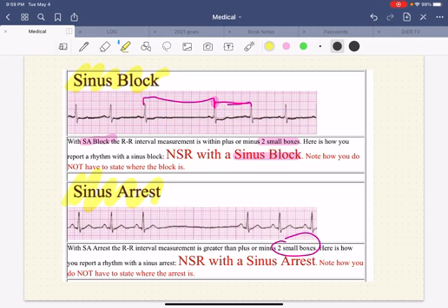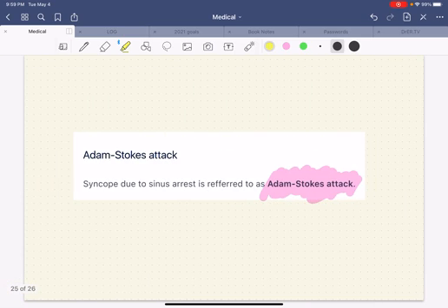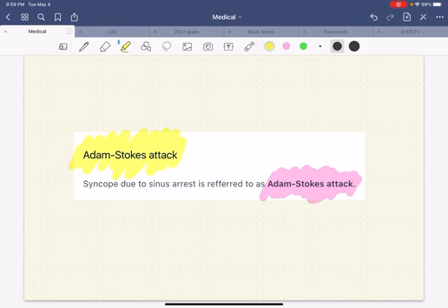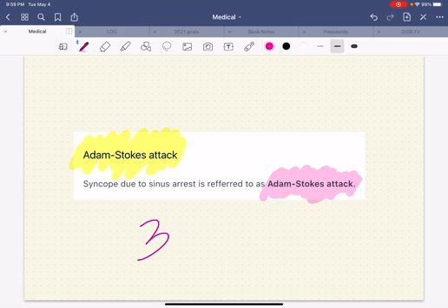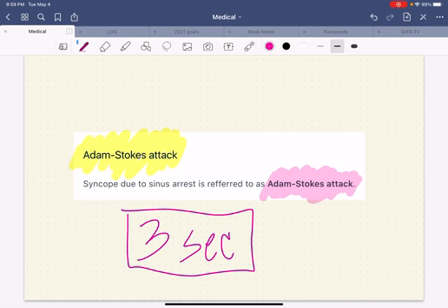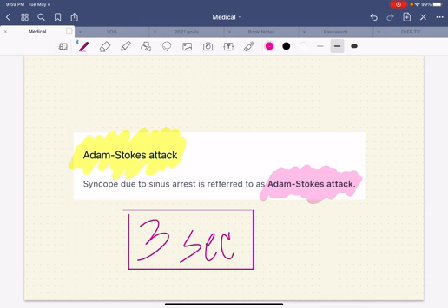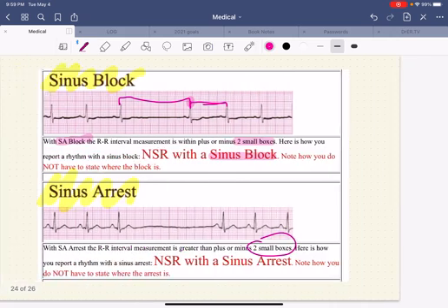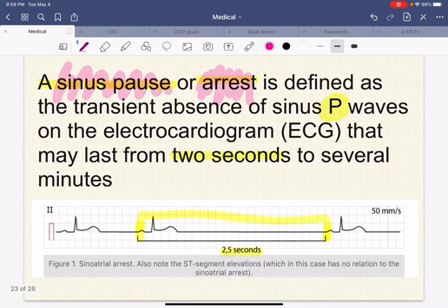The difference between sinus block and sinus arrest is that there is a pause but it doesn't meet the criteria of more than two seconds. If somebody passes out because of a sinus arrest, we call that an Adam-Stokes attack. For people who have more than three seconds of pause and are symptomatic, those patients will probably need a pacemaker and more definitive intervention. For those who have only minor symptoms, you can give atropine or similar medications to increase the heart rate.